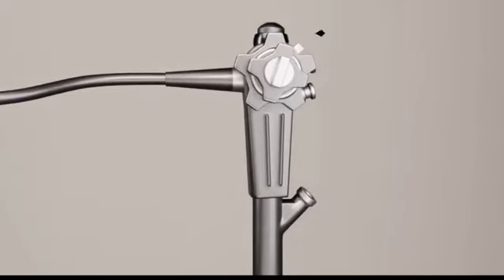Eyepiece and video controls. Traditional endoscopes comprise an airtight and waterproof elongated tube having a distal end with an objective lens for imaging and a proximal end with an eyepiece for viewing. The function of the eyepiece is to magnify the image at the proximal end for the observer.